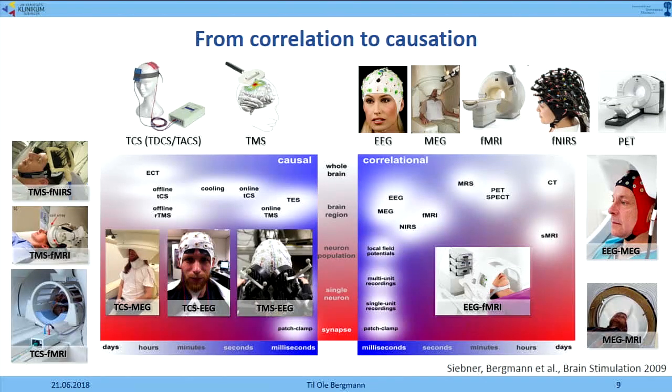And you're going to hear today examples of TMS-EEG, TCS-MEG, TCS-fMRI, and I'm going to focus on TMS-EEG and TCS-MEG today.